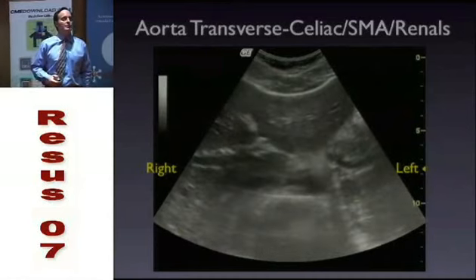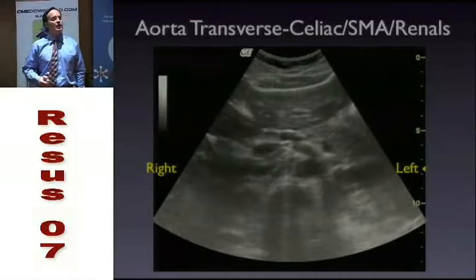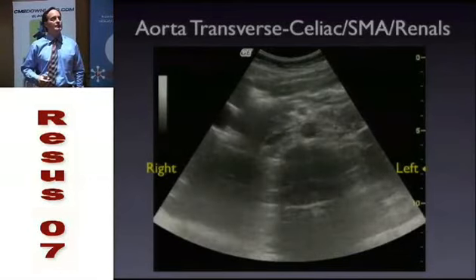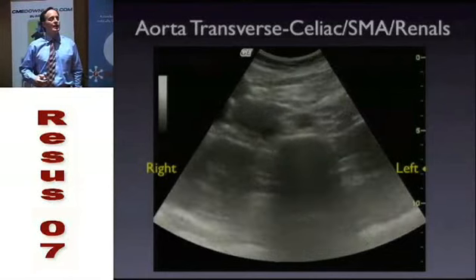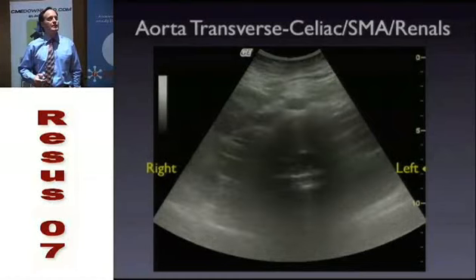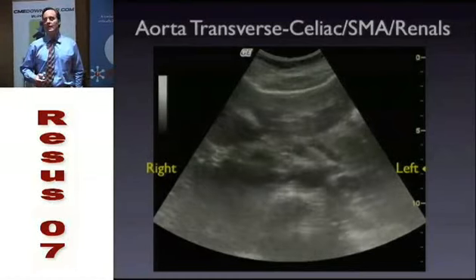Now let's look at one clip where we scan all the way from very proximal to distal. Okay? So again, we're going to have our spine here. This is the left and the right. Okay? There's the inferior vena cava. Here's the aorta. Now we're coming down further down towards the umbilicus here. Notice, here we come, and there's the pairing of the iliac.